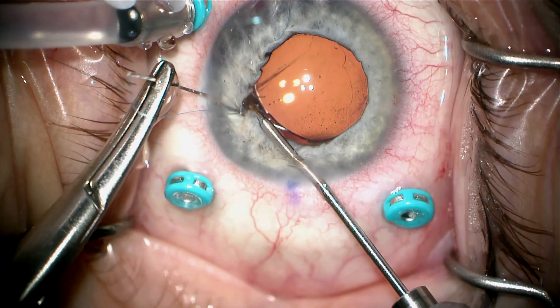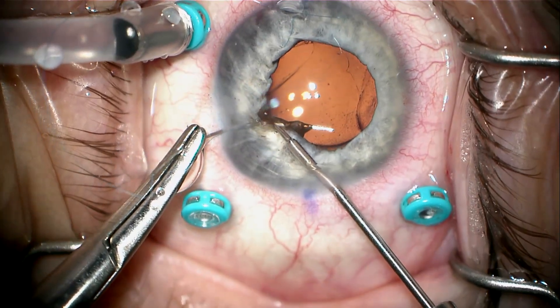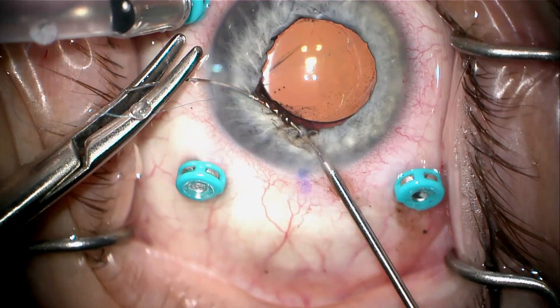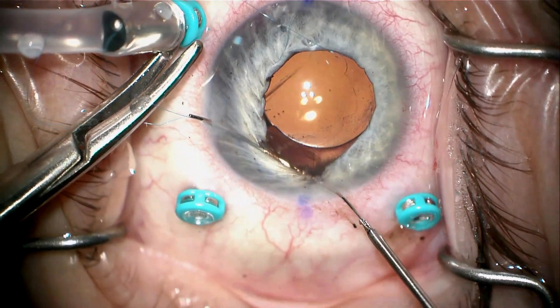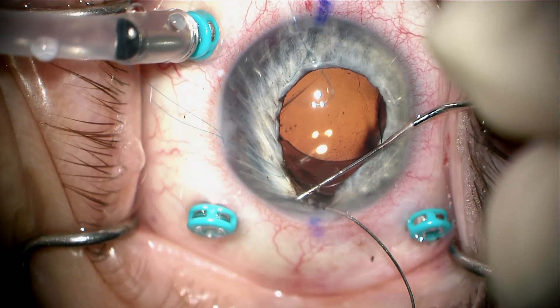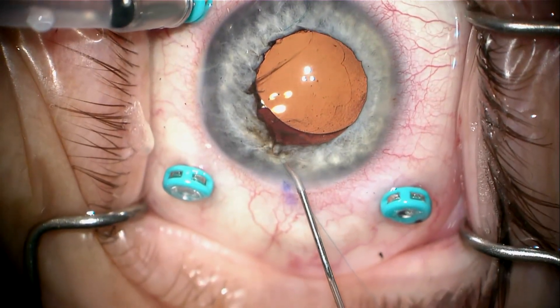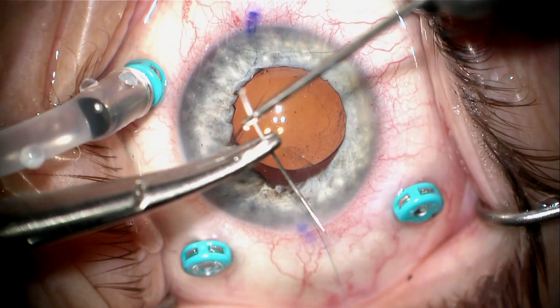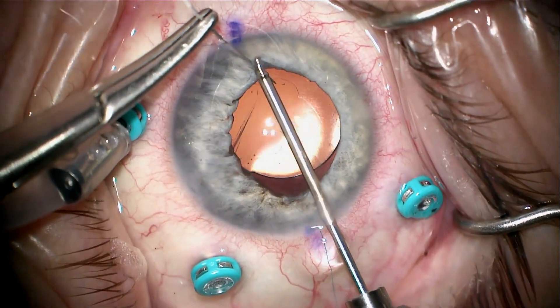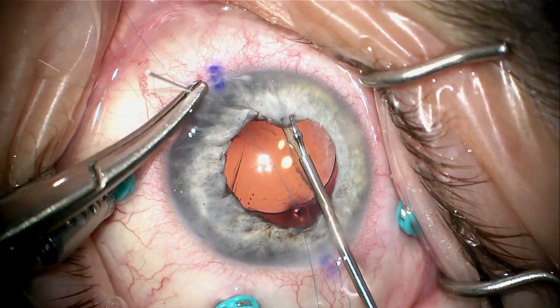I've switched hands — using my left hand to drive the needle and the right hand to work the iris around the tip. Even though my left hand holds the needle holder, it's really my right hand doing the bulk of the work by wrapping the iris around the needle. I'll edit this portion since you've already seen most of how I do this.